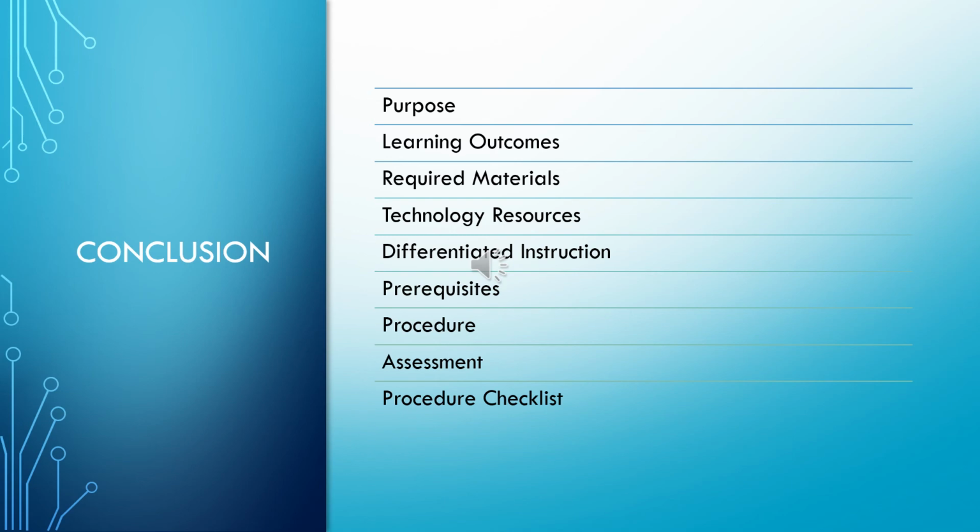The procedure we covered from all 3 parts: the pre-procedural, as we get ready, make sure we have all of our equipment, make sure our patient is aware of what we're going to be doing and how. The procedure itself was covered, and then the post-procedure, where we look at recording our results, informing either doctor and patient of those results, and then if there's a need, providing treatment to alleviate any type of abnormalities in the sugar level. The assessment you will conduct in the lab.